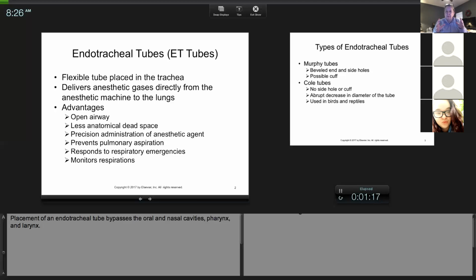The animal has to inhale the oxygen and anesthetic and get it to diffuse in the blood. So you have to conceptualize for a minute. When you have an animal that is intubated and hooked up to a breathing system that's hooked up to a machine, the machine in all of its parts, all of the tubing, and the animal are all connected.